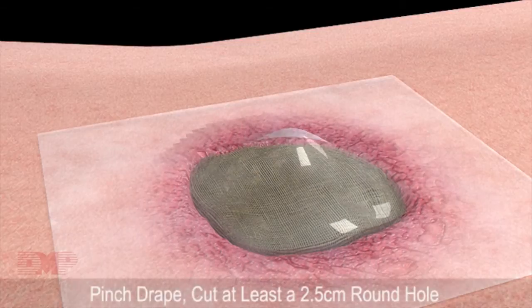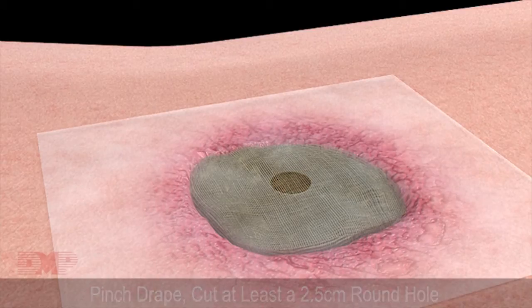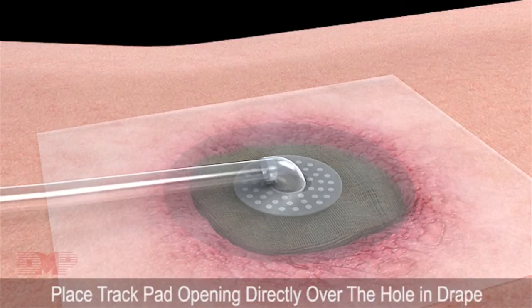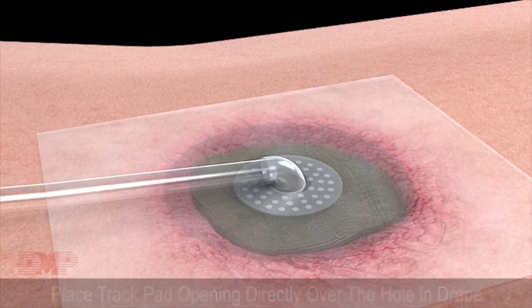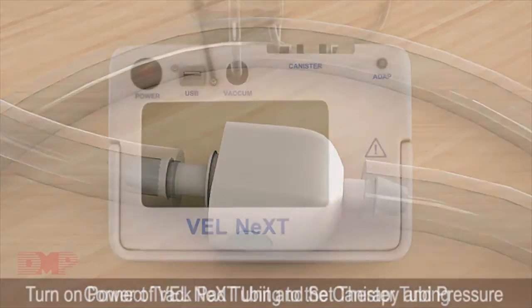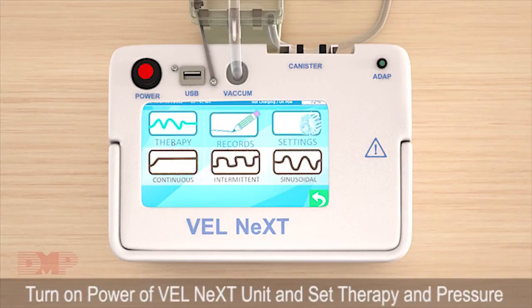Pinch the drape and cut at least a 2.5 cm round hole. Place the track pad opening directly over the hole in the drape. Apply gentle pressure to secure the track pad. Connect track pad tubing to the canister tubing. Turn on the power of the Velnext unit and set therapy and pressure as directed by the doctor.